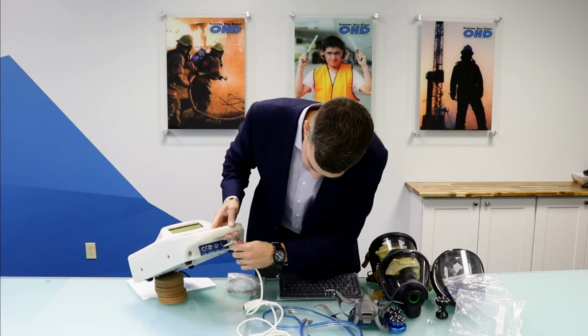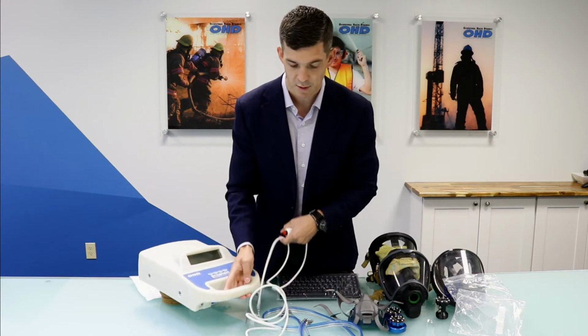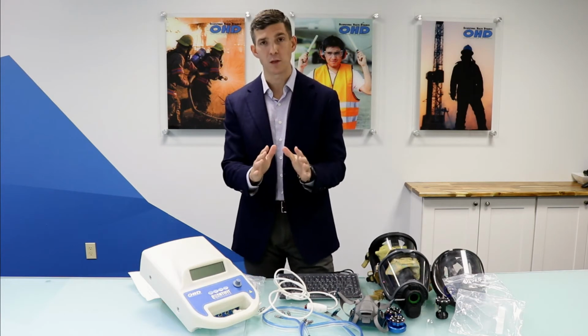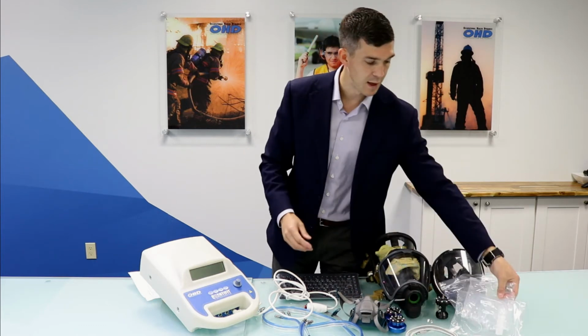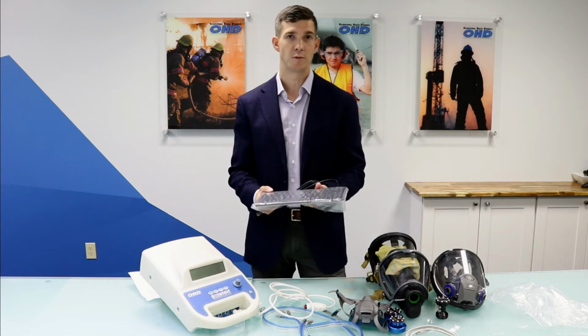So in the front, very easy to find where the trigger goes. It just goes in the trigger selection, and then your triple tube connections there. Two other things that will come in your case: a USB to PC cable, which we'll use during our fit test in just a second, and I'll set that there, we'll get to it. And then also a keyboard for standalone testing.